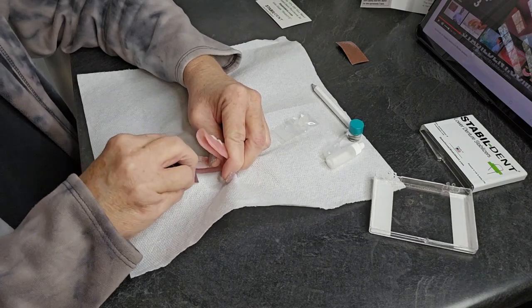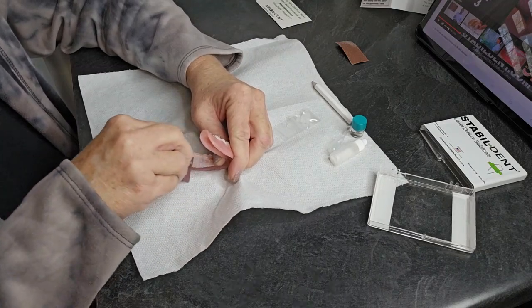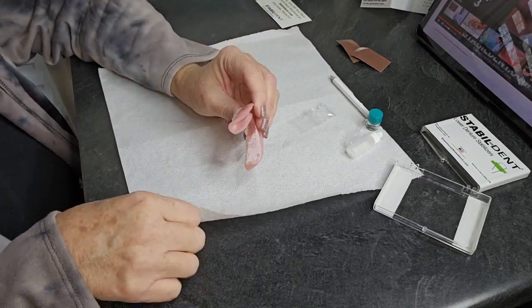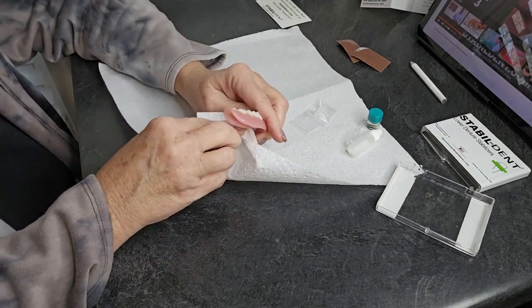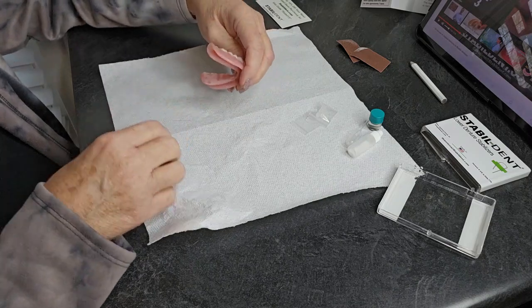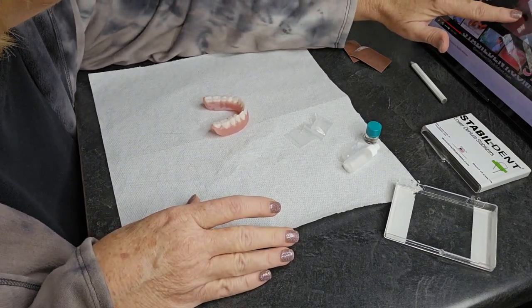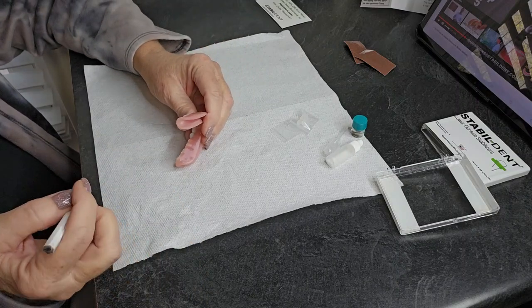First of all, you had to wash and dry your denture — we did that already before we started the video. Now we have this sanded surface. With other products I've used, don't touch your fingers to that surface — you don't want any oil on there because you don't want anything to make it not stick. It says draw a line at the middle of the last tooth.